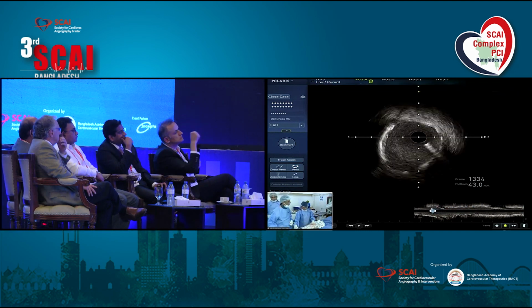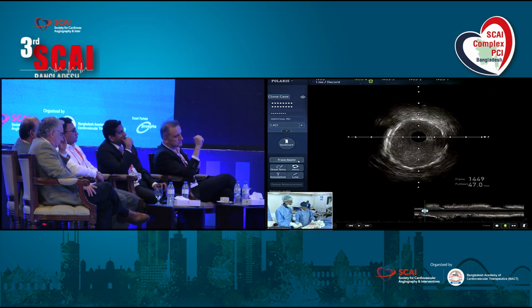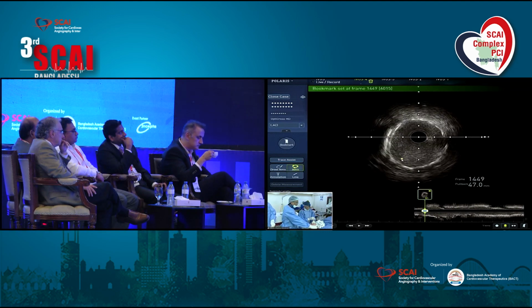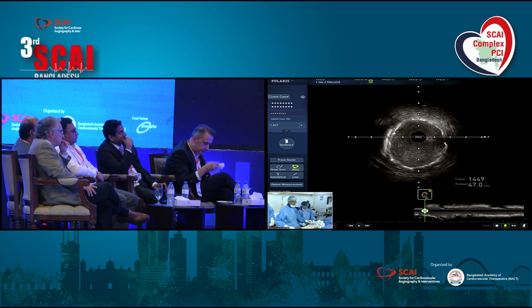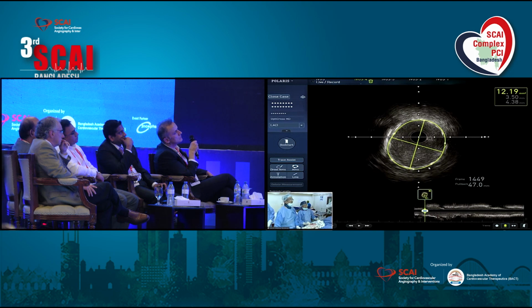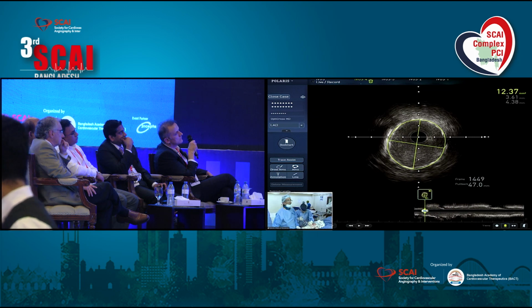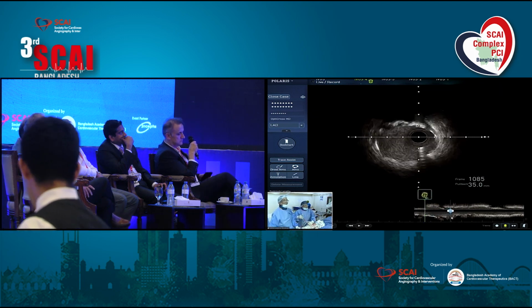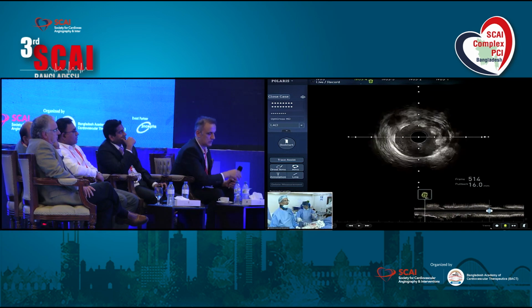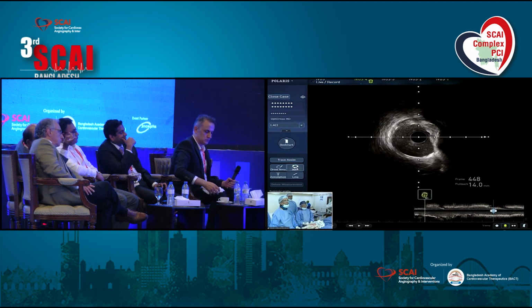Okay, so I think we showed you a case which is very interesting in my opinion, that we were able to cross the lesion with a floppy wire and a microcatheter, and we exchanged that for a balloon. Initially, IVUS did not cross, but we went with the 1.5 balloon, 1.0 balloon, and we were able to perform the IVUS after that. And now with the further pre-dilations, we were not very aggressive in pre-dilations, as you can see. We didn't use a Wolverine, we didn't use IVL because there was this fibrocalcitosis.